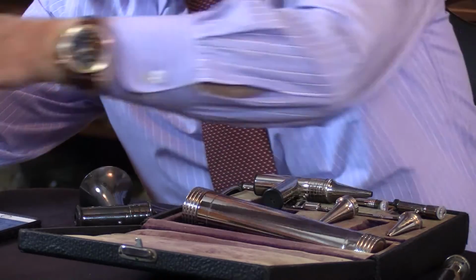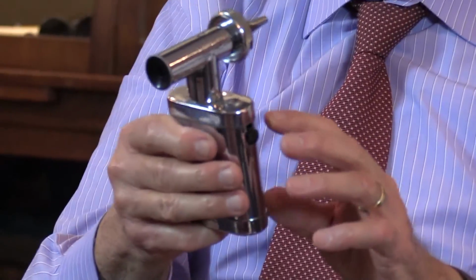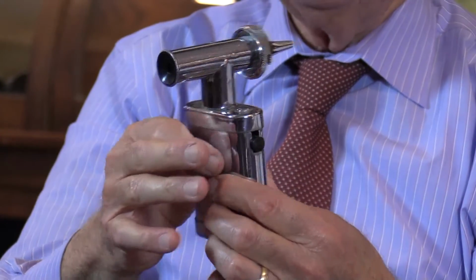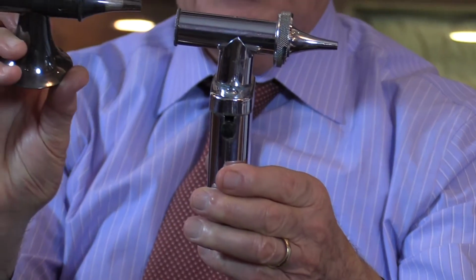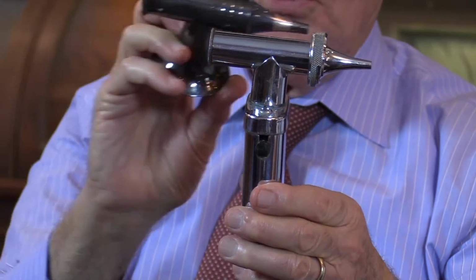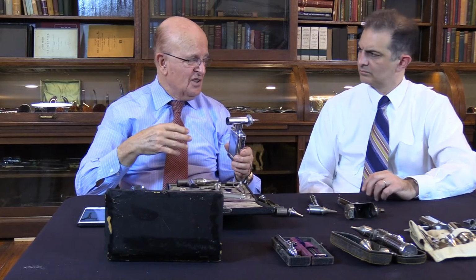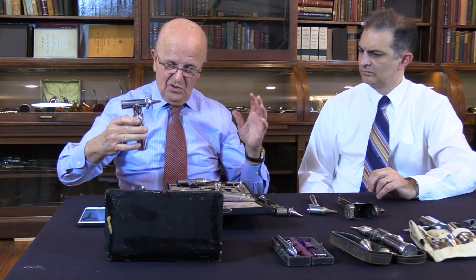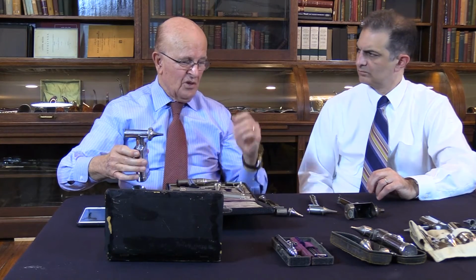Another thing that I found a few years ago is the battery operated. One of the earliest batteries is contained in this housing here. Again, if you look at it, it's a typical Brunton's with the channel and just the same principle. So these are the earliest electric otoscopes. And as you can see, it's all enclosed in one device, held with one hand.